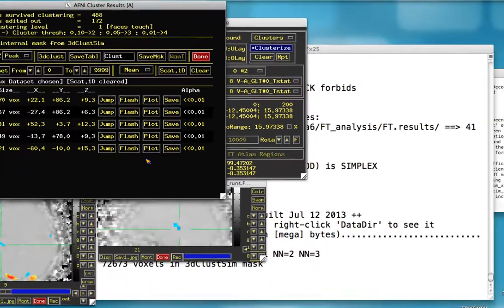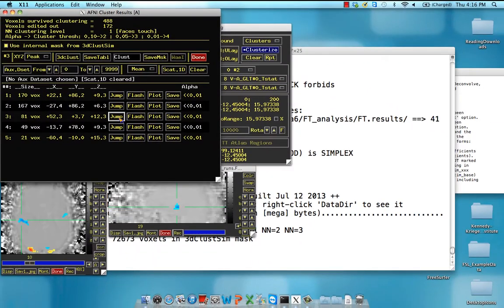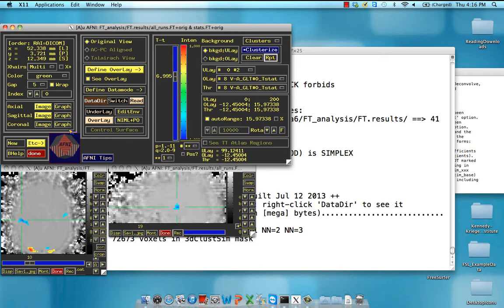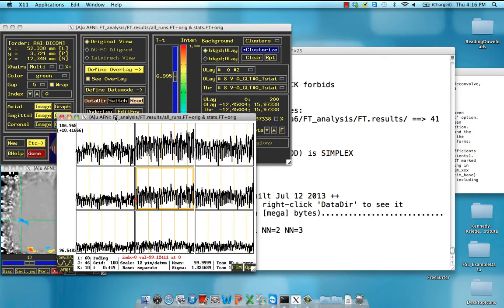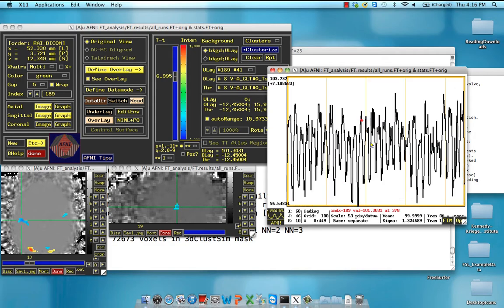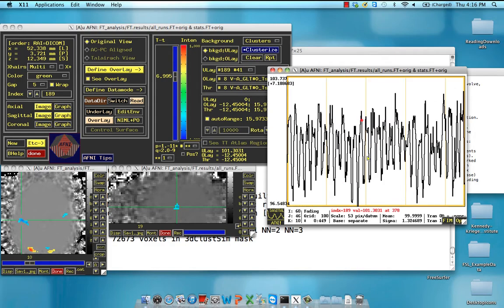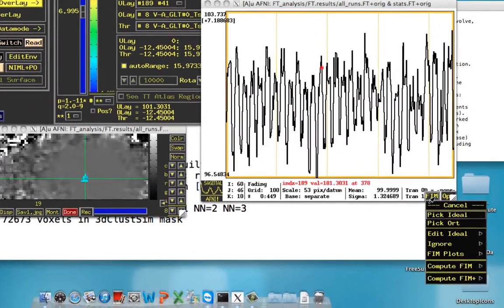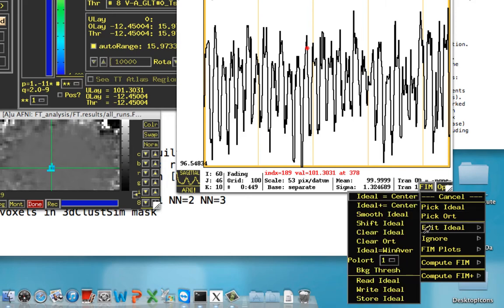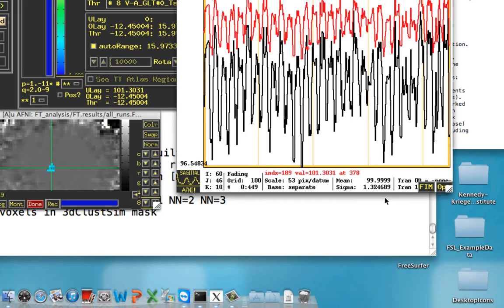So here's the cluster I'm going to be working with, this one right here. And we are going to use the time series of this voxel, the peak of this cluster. And we are going to click on this FIM right here, and we're going to say that our ideal, or our seed time course, is going to be the time course of this voxel. So click on Edit Ideal, and click on Ideal equals Center. Just copy and paste that right above there.